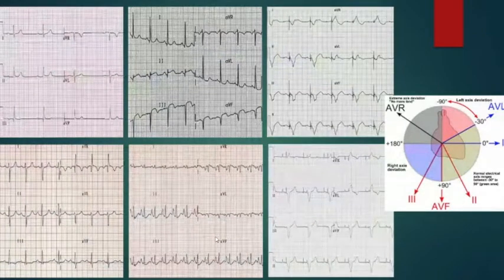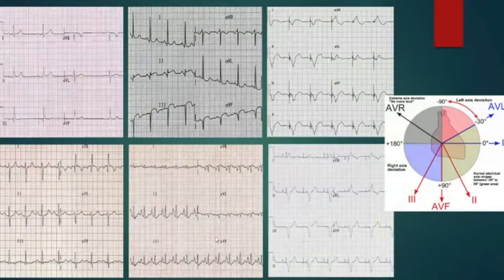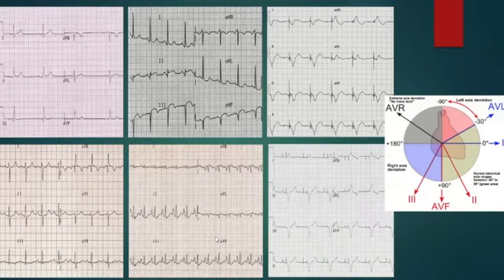I know it's a little bit complicated, but it's not that much. Usually when you explain the AV block, it's almost the same, but here you have to check the P wave, not the PR interval or the QRS complex. Do you understand it? A little bit, at least. So, SA block, first degree, you can't detect it with EKG. Usually you don't see any problem. You have to check it with an electrophysiological study, and it's not routinely used for this disturbance.